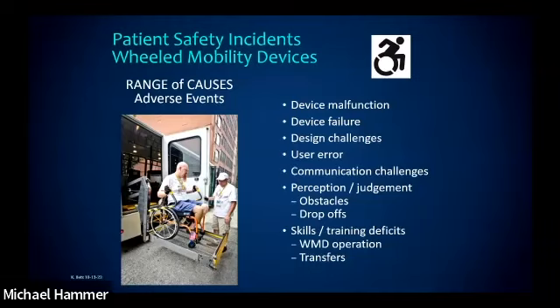Communication challenges, and I think this is one that we see often when we do a root cause analysis and look at what happened where this individual fell with their power wheelchair attached to them, is often a communication challenge, okay? So I don't see a lot where an individual fell out of a vehicle. So for example, when you see that type of issue, say you have a vehicle that has a platform lift or a ramp, and an individual is driving with their head and just does not have a good visual field for what's going on around them. When there's a communication challenge between the driver of the wheelchair and the driver of the vehicle, of is it time to come out of that van or not? That communication challenge can be catastrophic when an individual driving with their head is exiting a van where they think the platform lift or the ramp is deployed. Is it in place when it's not? And that's where we see those types of things.